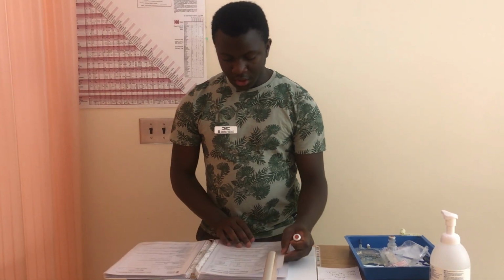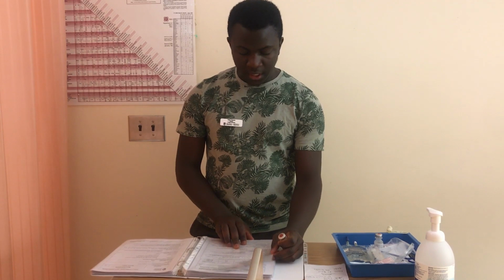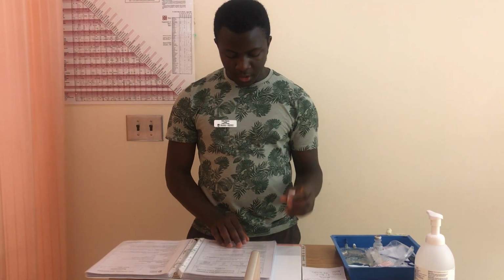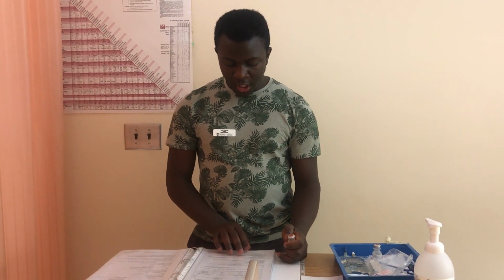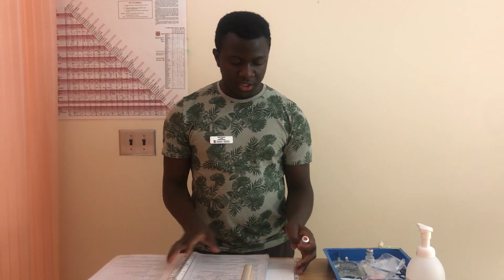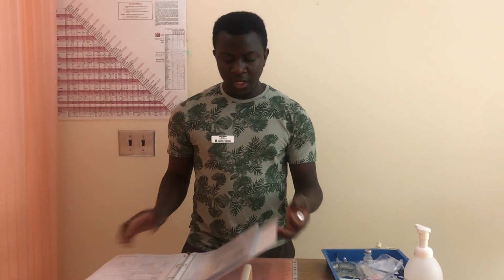This medication is compatible with normal saline, which is the fluid running in the patient's room, so I know my medication is compatible. Some potential hazards to watch out for with this medication are sodium retention, edema, increased glucose level, or peptic ulcers not healing. I'll make sure I educate the patient on these signs. So I have checked my monograph, and I'll go ahead and prepare my medication now.